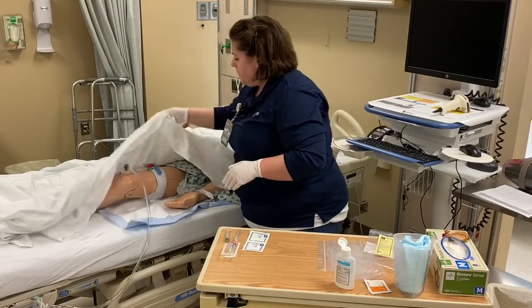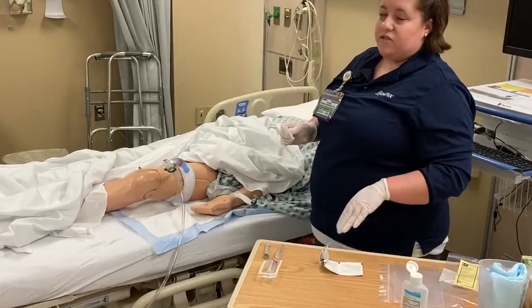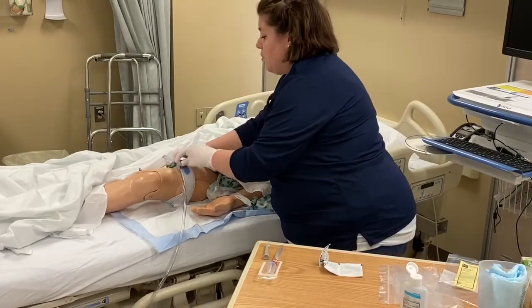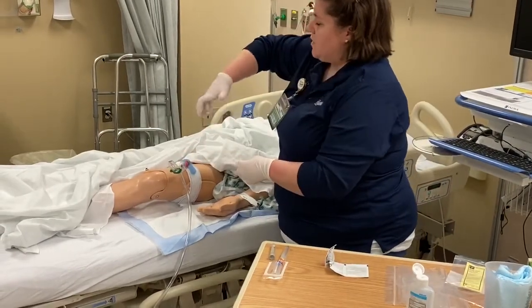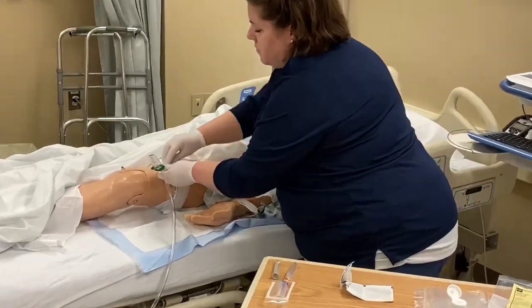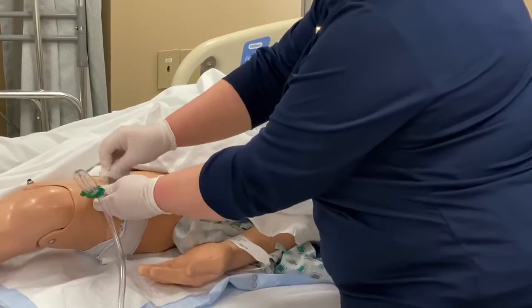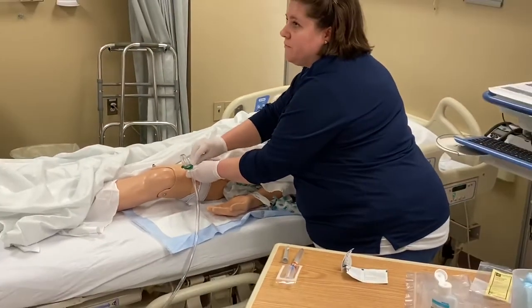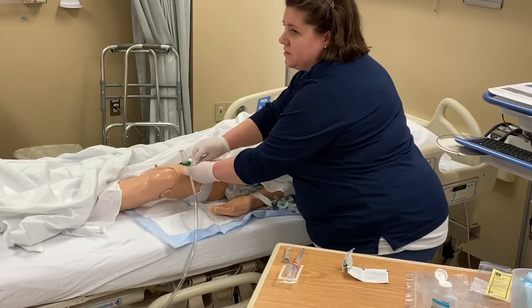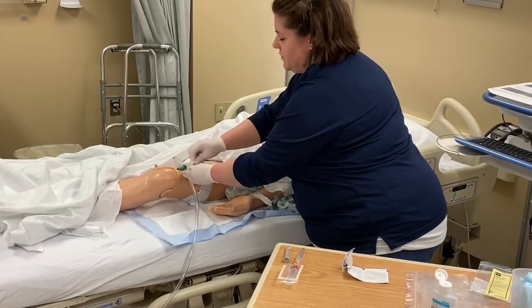All right, so I'm going to get my alcohol wipe and looking at the clock to make sure I'm cleaning for a full 15 seconds, I'm going to clean my port right here. And I want to clean this almost like I'm opening a jar to make sure that I get the tops and the sides. So I'm going to clean for 15 seconds. 5 seconds. 10 seconds. All right, there's 15 seconds.